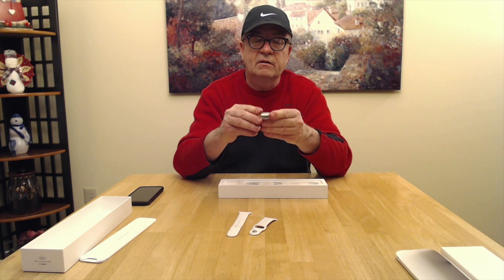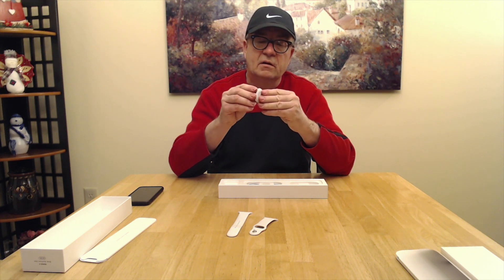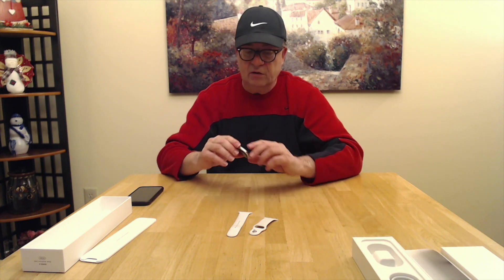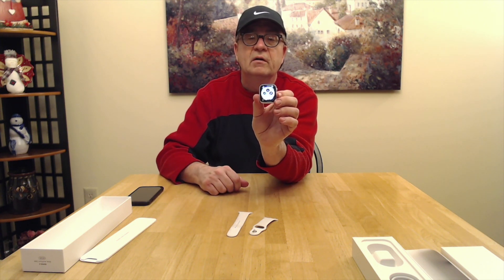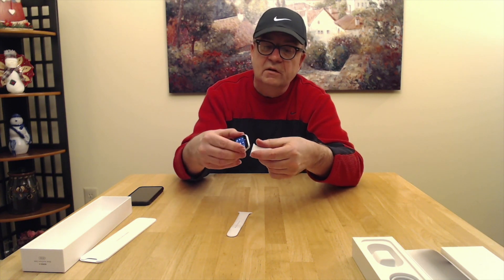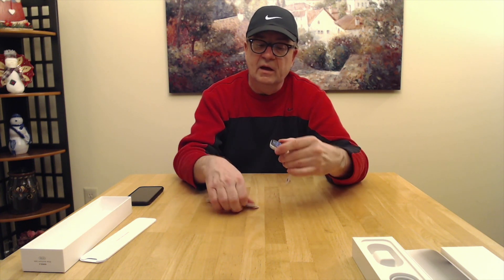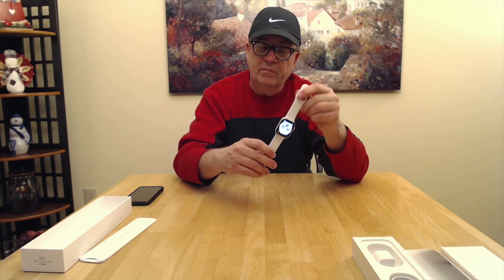Here's the watch itself — it's held in there very securely. The watch is already on and powered up by the miracle of YouTube. We're going to install the bands now. You put the shorter piece on the top — just slide it in and it locks in place — then you put the larger one on the bottom and it locks in place. There you go, you have your watch.